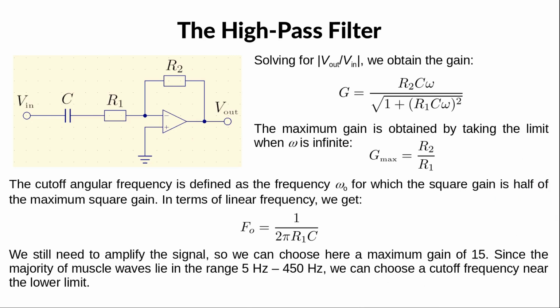This expression confirms that what we have is a high-pass filter, since the gain vanishes when the angular frequency omega is 0, and it increases as omega increases. The limit where omega goes to infinity gives us the expression for the maximum gain, R2 over R1. Now it is common to define the cutoff angular frequency omega 0 as the frequency for which the square gain is 1/2 of the maximum gain. I'll let you solve this equation, and you should find that omega 0 is simply 1 over R1C, so the linear cutoff frequency f0 is 1 over 2 pi R1C.